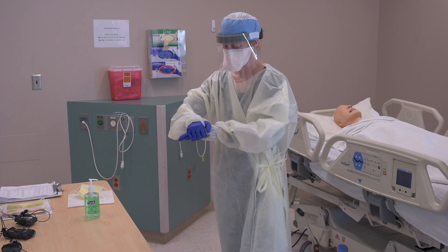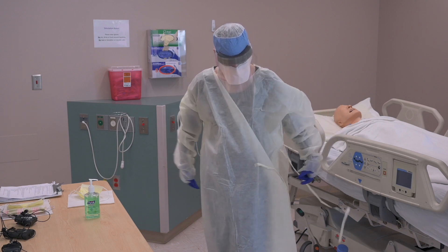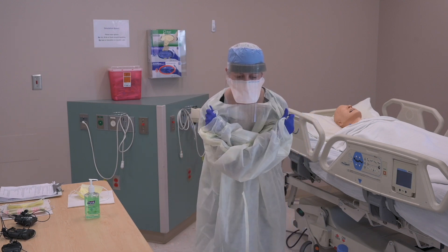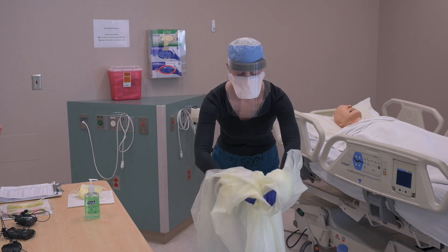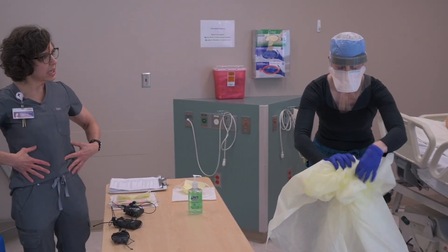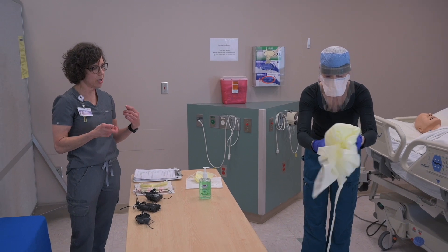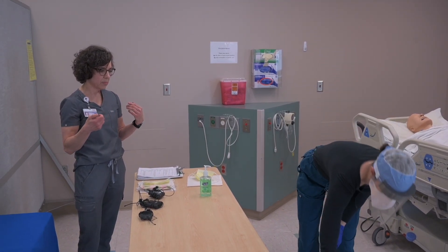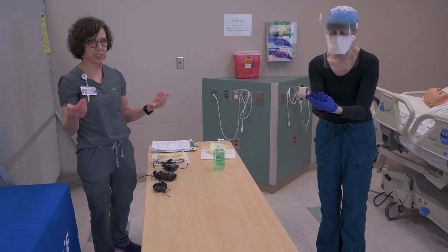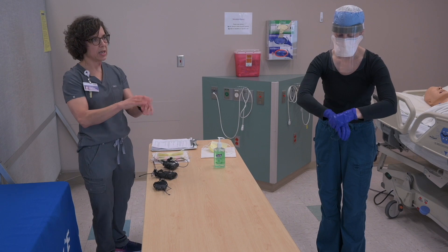Now you're going to doff that gown — start by untying the gown at the waist. Then doff that gown by leaning forward and turning it inside out. You'll notice she slowly rolls that gown up leaning it away from her body, touching only the part that was against her scrubs and being very careful not to touch any part that was external-facing. She'll roll that up in a small ball and gently discard it in the garbage can, then perform hand hygiene. We perform hand hygiene after every step of doffing a piece of PPE, just in case there are viral particles on our gloves during that doffing process.